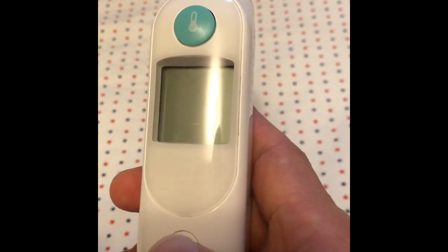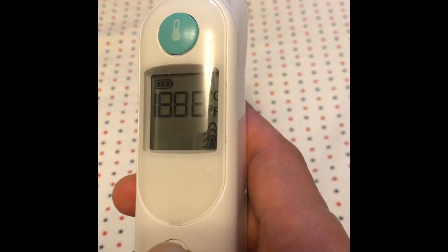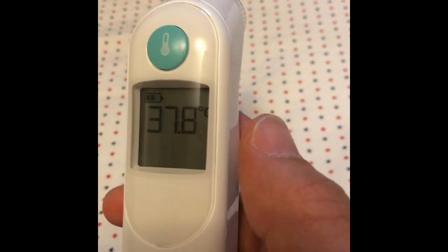I turn it on again and keep pressing the power button. Now Fahrenheit... now Celsius. I release it and it returns to Celsius degree.